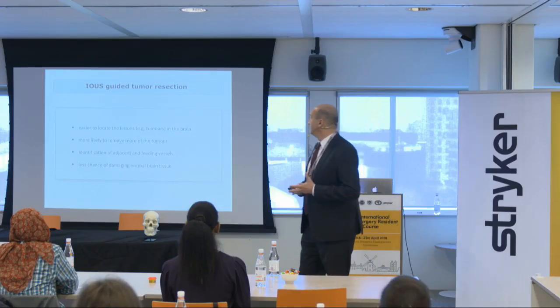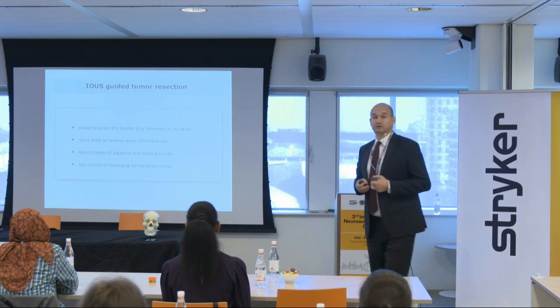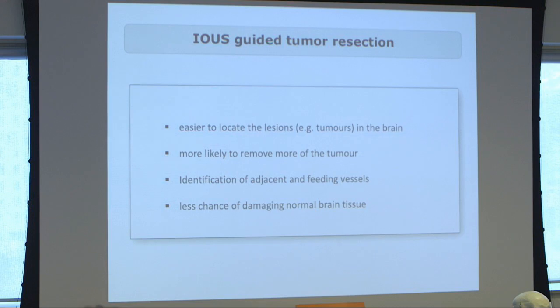So for tumor work, ultrasound is a great help. It will show you the lesion. It will help you judging vessels that go into the lesion or go past the lesion. You reduce the risk of damaging tissue on the way down to whatever you want to do.